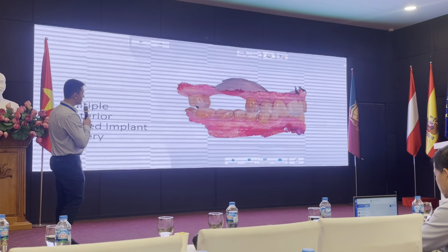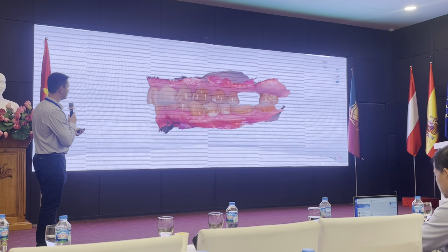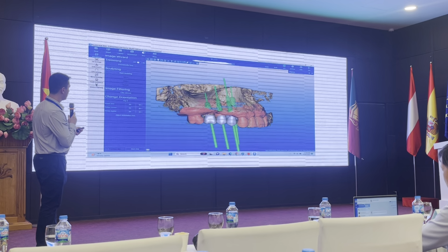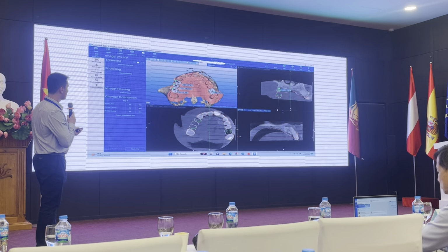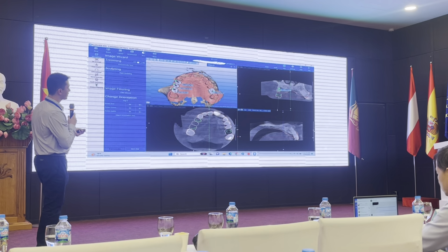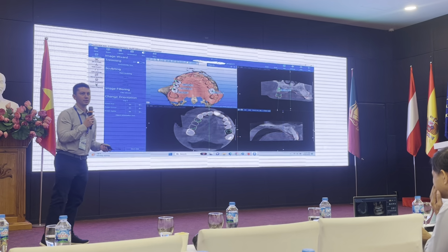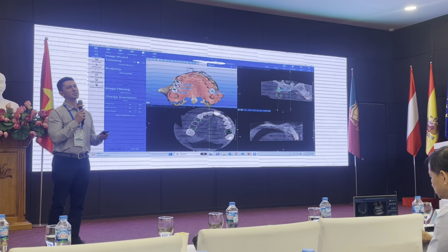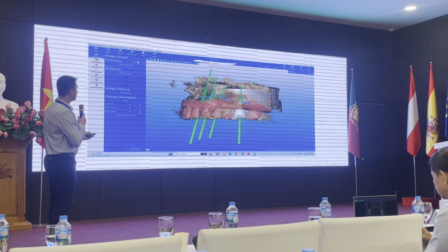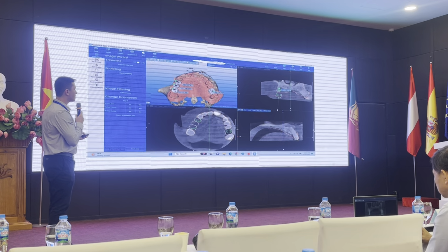Some of these cases are repeats because we saw them earlier, but this was the case with multiple missing teeth, and we saw this planned already. So we're going to go through this a little bit quicker. But these types of cases go so much quicker whenever you've planned everything in the comfort of your office or on a computer, and you have time to study. You look at the bone height, and you look at the room. What are the teeth going to look like?